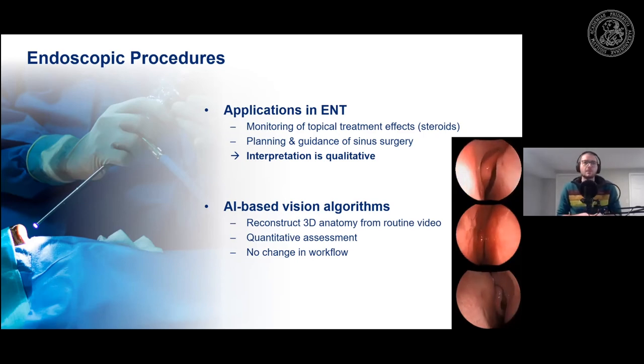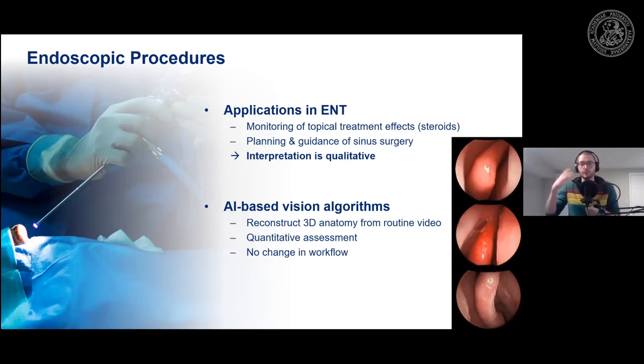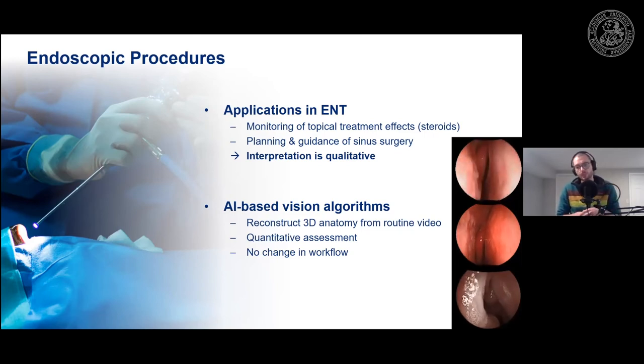And this is really where there is a lot of potential for AI-based vision algorithms, because they can potentially allow us to reconstruct these videos, essentially reconstruct the three-dimensional anatomy from these videos that are acquired routinely in clinical practice, which, once we have three-dimensional representations, would enable quantitative assessment. And because it's all based on routine endoscopic video, there is no change in workflow. It's simply added benefit without any change to workflow, which is very, very appealing.